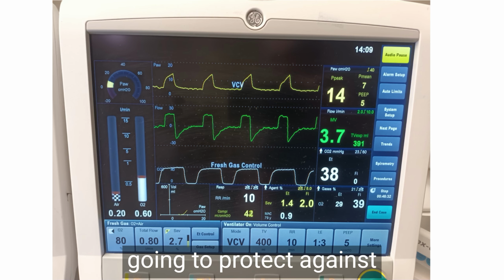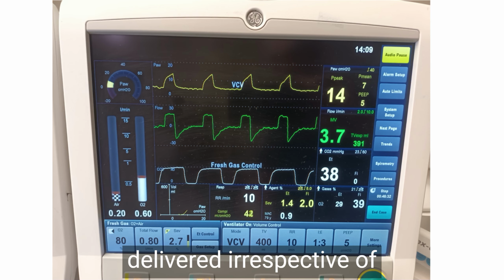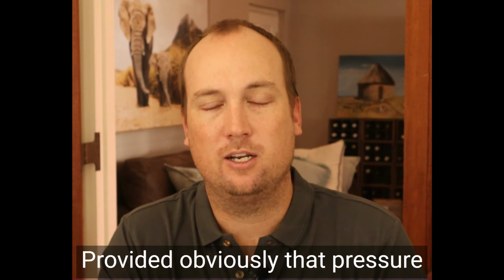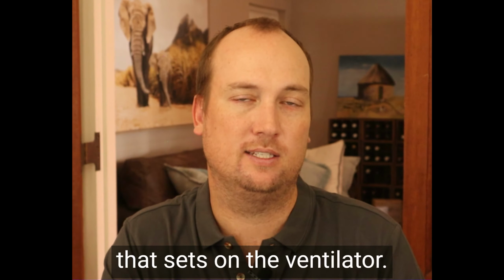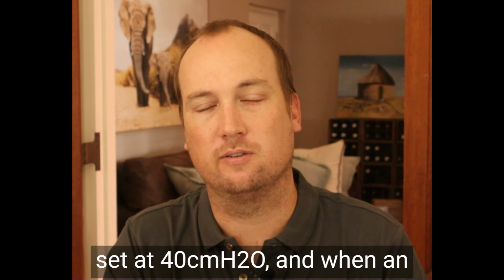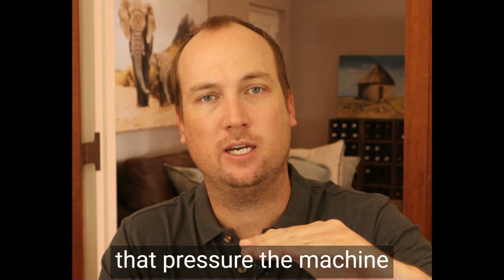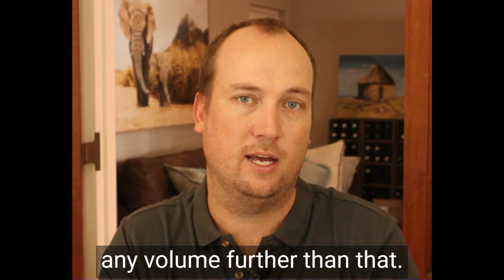As I've said, volume-controlled ventilation should be the mode that the trainee anaesthetist uses, because it's most likely going to protect against missed hypoventilation. Each volume is going to be delivered irrespective of what pressure is generated, provided obviously that pressure is below the pressure limit that's set on the ventilator. So in our ventilatory settings, there's a limit. It's normally set at 40 centimeters of water, and when an inspiratory volume generates that pressure, the machine cuts off and it doesn't deliver any volume further than that.